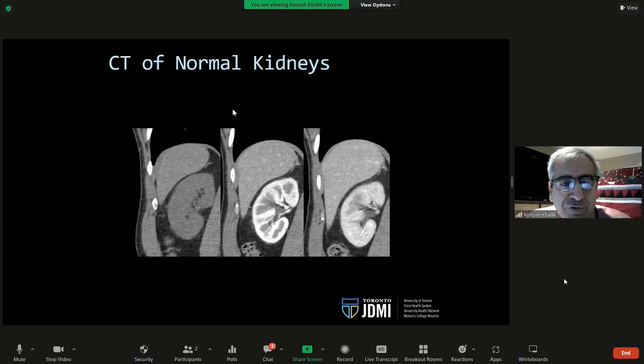If you've ever had a CT scan, you'll know that often we'll inject the patient with a large volume of high density contrast, and you'll feel very hot and warm for about 30 seconds as the injection goes in fast. We're doing that so that we can introduce some contrast in your body so that we can start seeing the differences in the soft tissues.